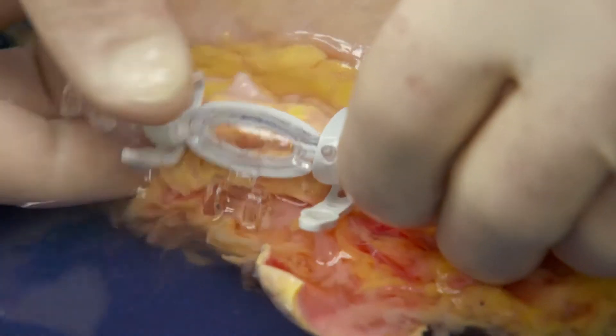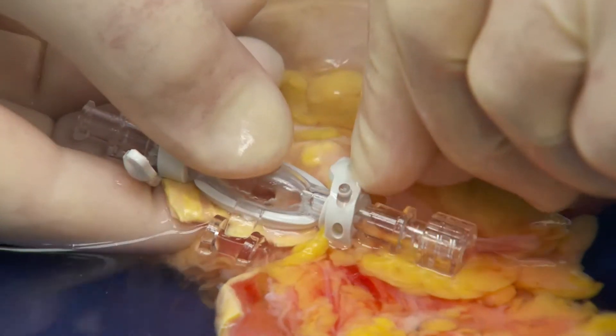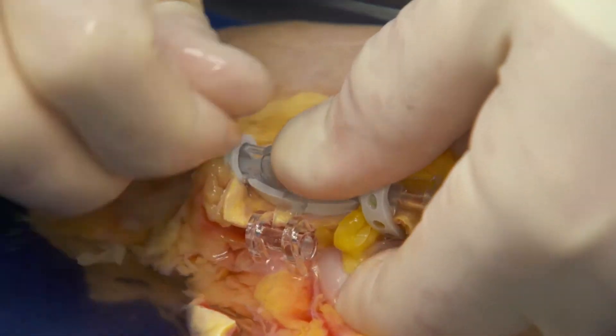Once the patch is laid flat, close the top portion of the cannula onto the patch to create the seal. At this point, continue to apply pressure while tightening the outer rubber tensioning straps, which will form the seal. At this point, cannulation is complete.